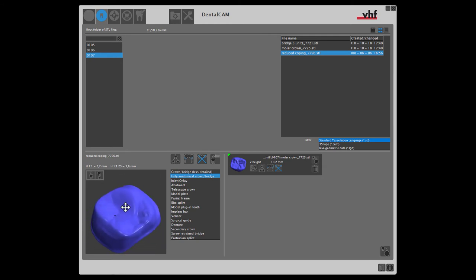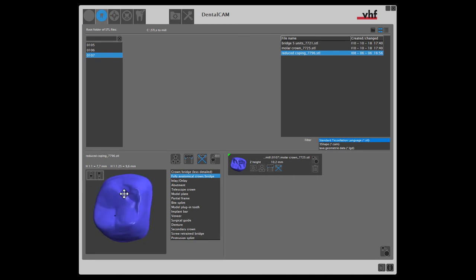Since a reduced coping has no detailed fissures, we'll choose the indication from the list. With this selection, the processing time for the object is shorter, as it is not processed with fine fissure tools.